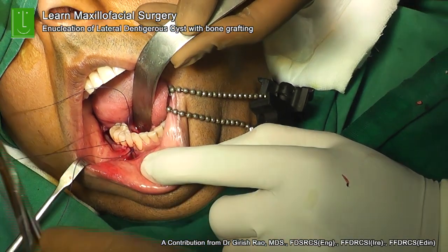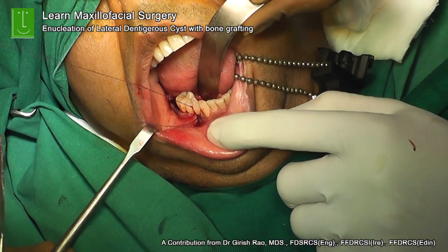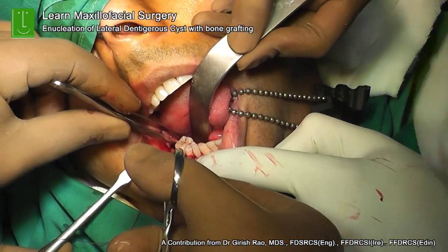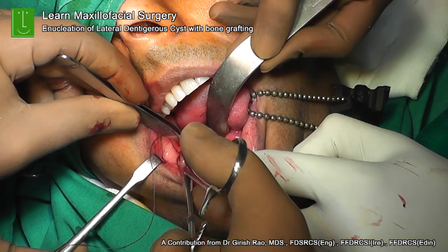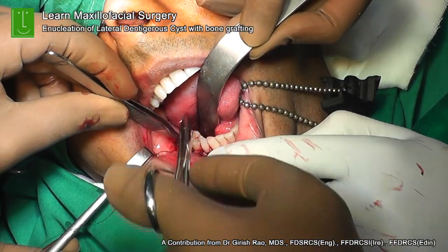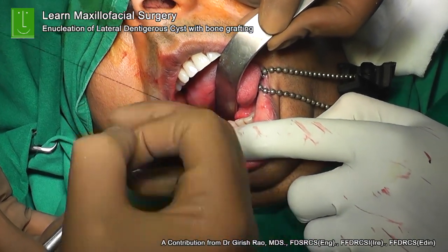In addition to watertight closure, it is mandatory to have a tension-free closure. These two principles of suturing really help in prevention of a dehiscence. Now, if you get a dehiscence when you put a graft material in, saliva and food material can go into the cyst cavity and your graft will get infected. So it is absolutely important that you do not get dehiscence. So you need to be extremely meticulous in the way in which you get your suturing correct.